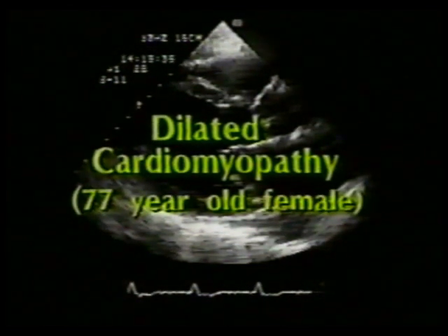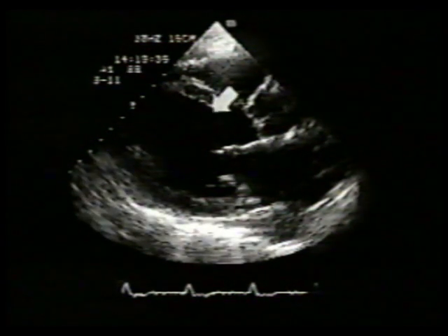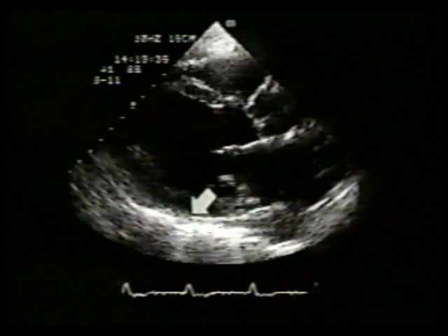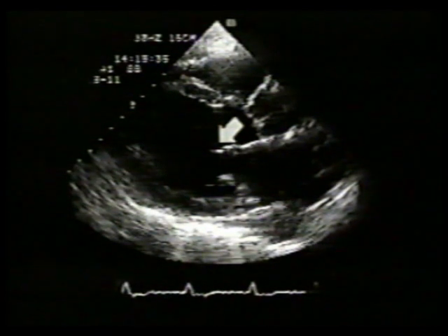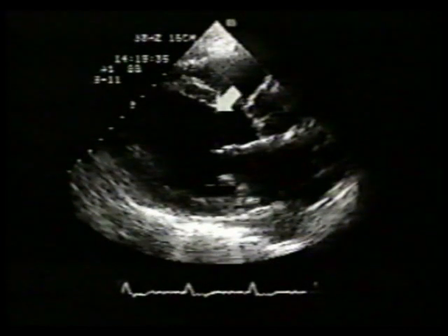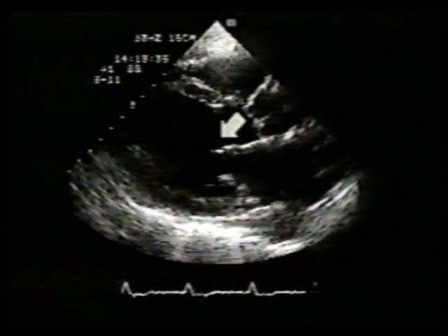This is a parasternal long-axis diastolic still frame from a 77-year-old female with idiopathic dilated cardiomyopathy. The left ventricular chamber and the left atrium are enlarged. The left ventricular walls are normal in thickness. This frame was selected because the mitral leaflets are at the point of maximal early opening excursion. Note the 2.5 centimeter displacement of the mitral anterior leaflet from the septum. Normally this separation is less than 7 millimeters.